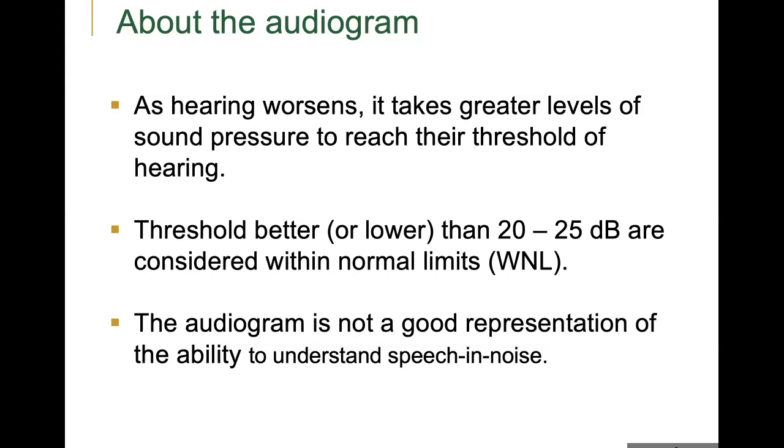Do you go out into the world and listen to pure tones? Do you communicate using pure tones? No, not necessarily. So if you think about it like that, it makes sense that a person's ability to hear a pure tone in a quiet environment might not be a good representation of their ability to hear speech, which is a complex signal, not a pure tone, in noise.